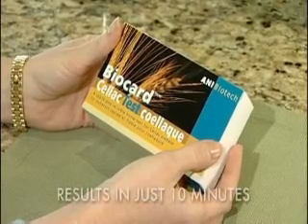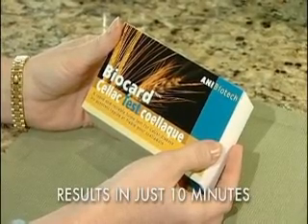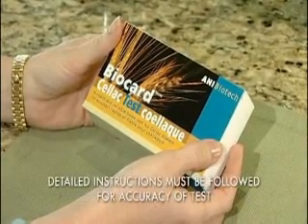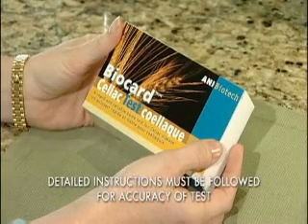It's convenient, easy to do at home, safe, and proven simple to use. Results in just 10 minutes, and shown to be as accurate as laboratory tests, affordable, and safe.